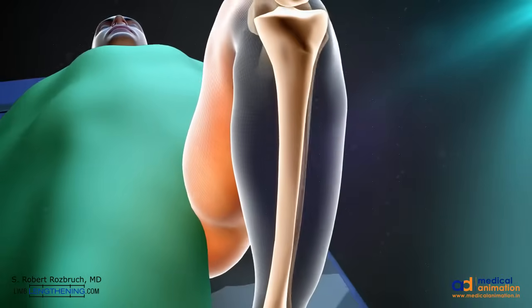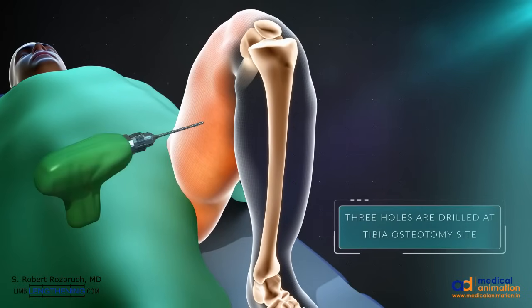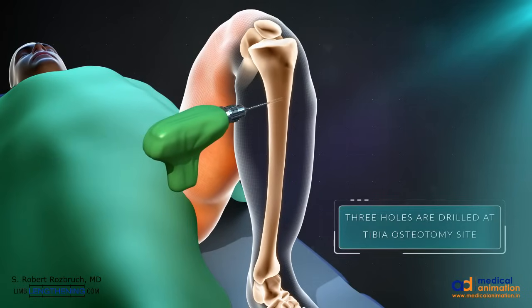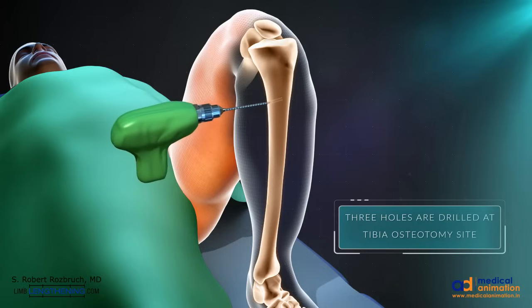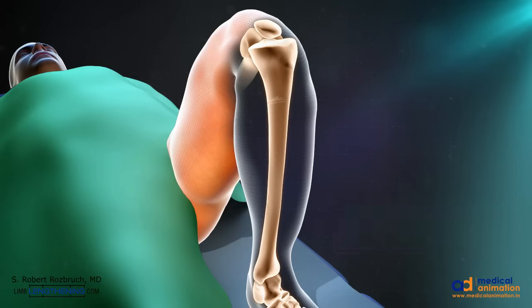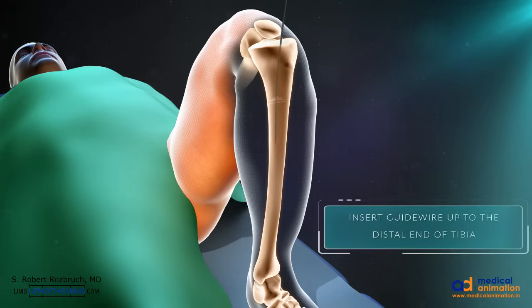Next, through a minimal incision approach, the first step of the tibia osteotomy is performed by making multiple drill holes. This is done through a limited incision. This first step of the osteotomy allows bone marrow to egress during the reaming, which you can see over here.